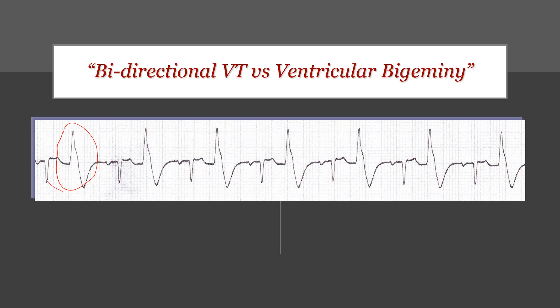Between these two beats, I'd be expecting the beat in the middle to happen somewhere here in the middle, but actually this beat has happened earlier than expected, followed by a pause — and the same applies here. In addition to that, normal beats are preceded by a clear P wave, while the PVC is not preceded by a P wave because it's coming from the ventricle.